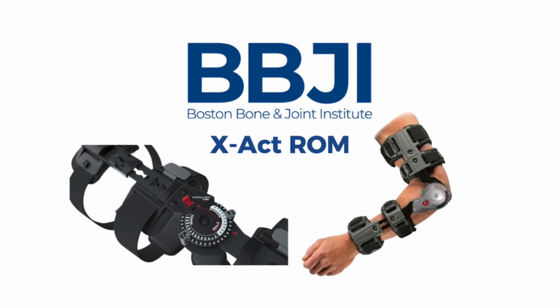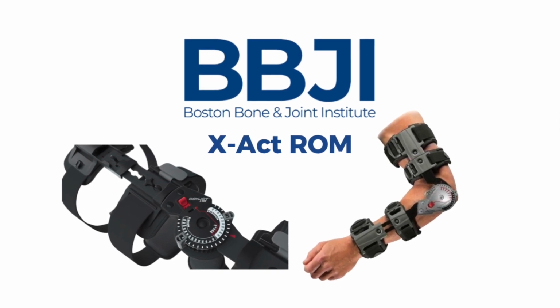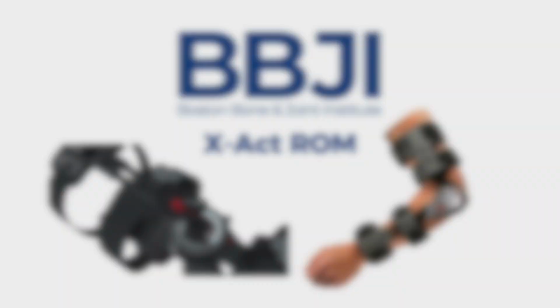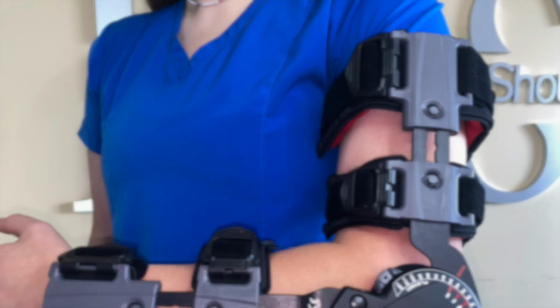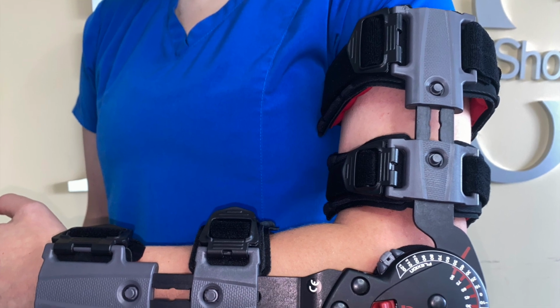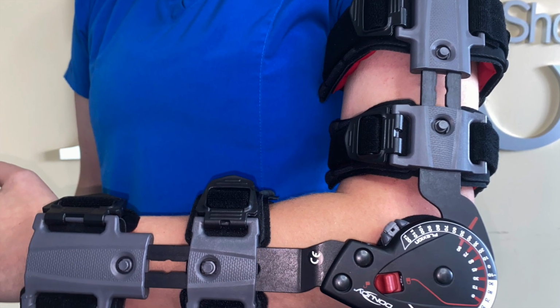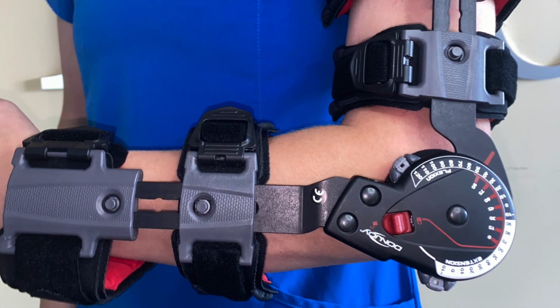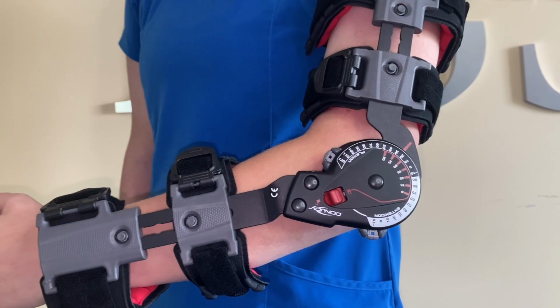If you're watching this video, you may have a few questions about your XROM elbow brace by Donjoy. This is the XROM elbow brace by Donjoy. This brace is called a ROM due to its abilities to achieve total range of motion with both elbow flexion and extension. This brace has the ability to lock in extension or flexion, allowing for mobilization of your elbow.